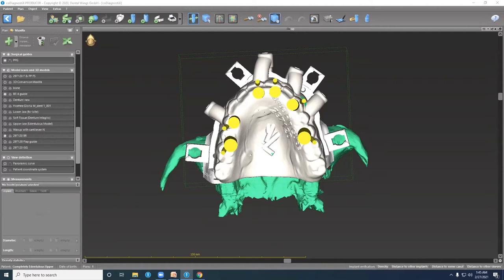I have a question about full arch restoration, and if it's done through the surgical guide. And the answer is yes, only if you're using a fully guided surgery and if you place your implants through the surgical guide. So you always want to make sure that you're using a fully guided surgery kit that allows for implant depth positioning or implant depth control through the surgical guide, because only then we can predetermine the implant position, orientation, and depth stop, so that the prefabricated restoration goes in place without any hiccups.